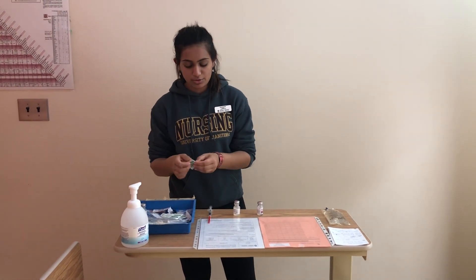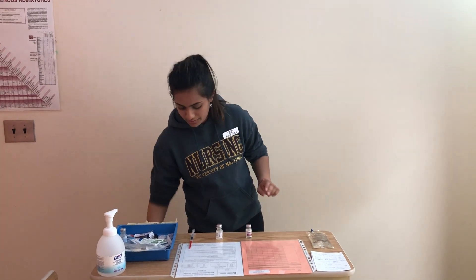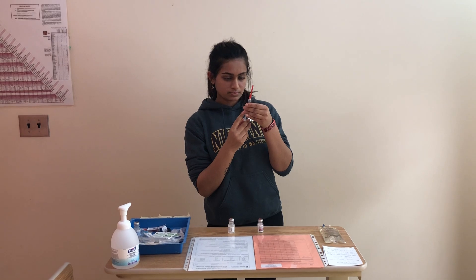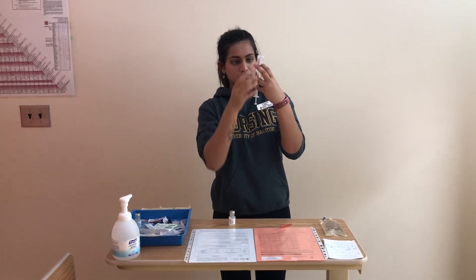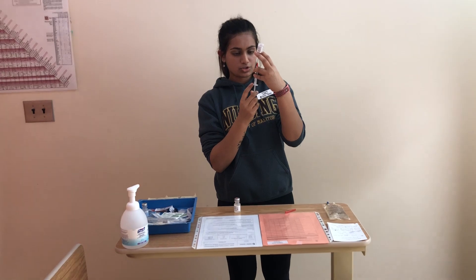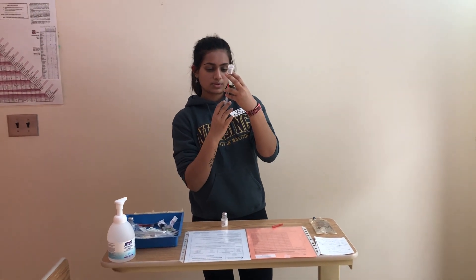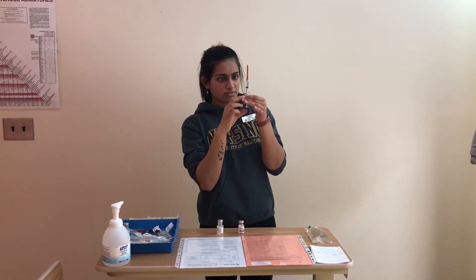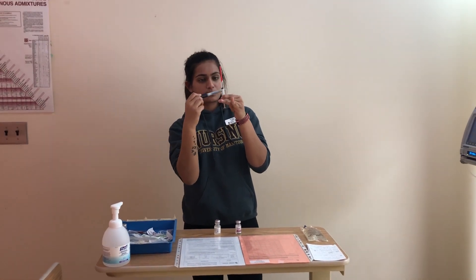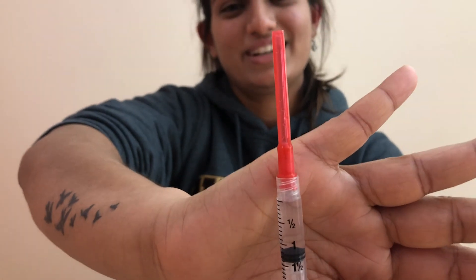I'm just going to re-swab the vial to obtain my ordered dose of 75 mg, which is 1.2 mL. Swab for 30 seconds, let it dry for 15. Drawing up 1.2 mL and getting rid of any bubbles. Recapping, making sure I have the correct dose — no bubbles. It's 1.2 mL.